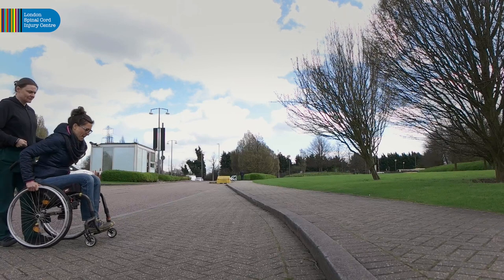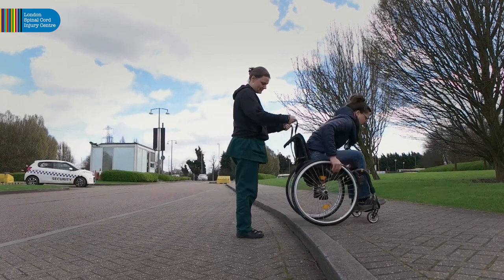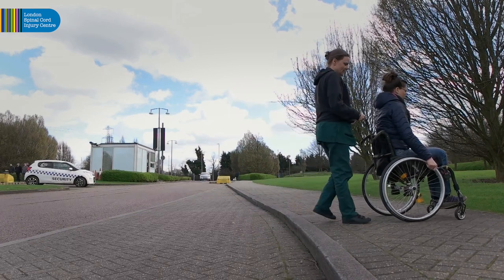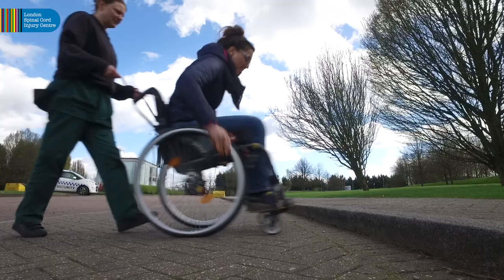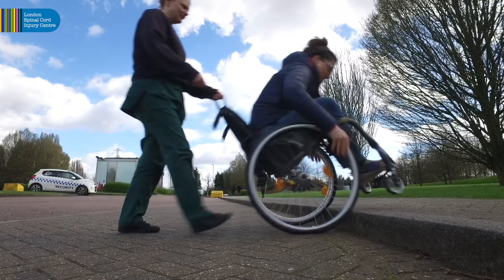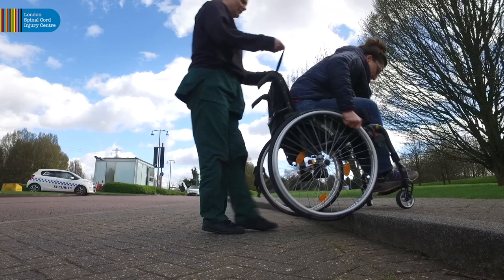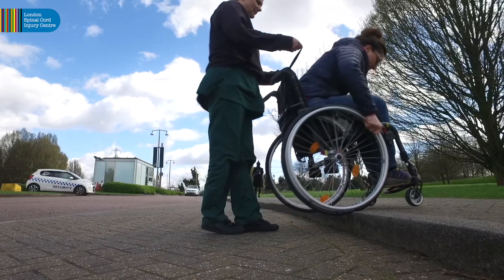To ascend a kerb, the person needs to push towards it, maintaining forward momentum between pushes. Two to three pushes are often enough. When approximately five inches from the kerb, carry out a short, firm push on the wheels to flip the casters, whilst again maintaining forward momentum and simultaneously leaning forward.